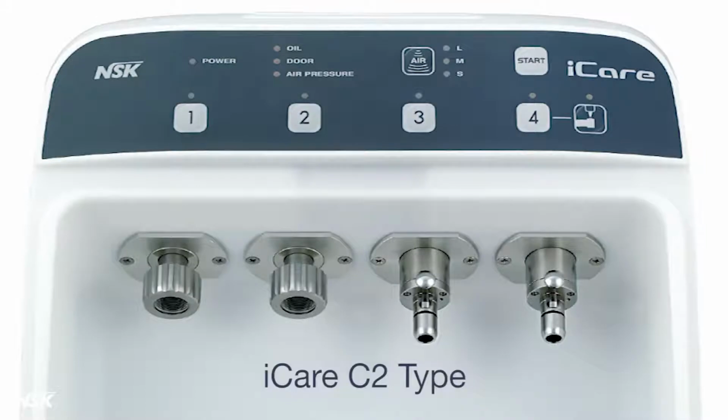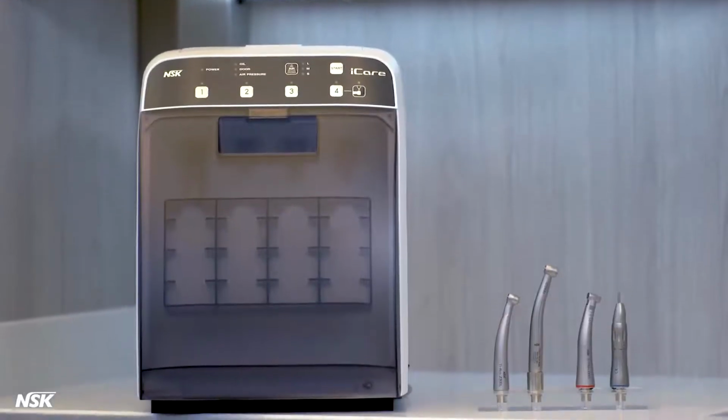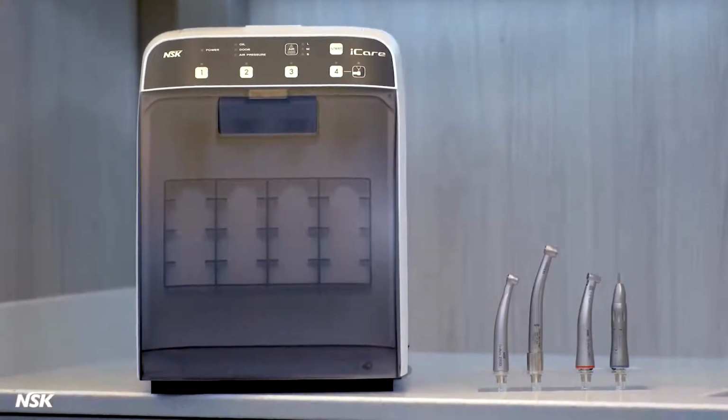The iCare C2 has 2 rotary ports and is recommended for offices using primarily air-driven high speeds. The iCare C3 has 3 rotary ports and is recommended for offices using primarily electric handpieces. For this demonstration, we'll be using the iCare C2. Let's begin.